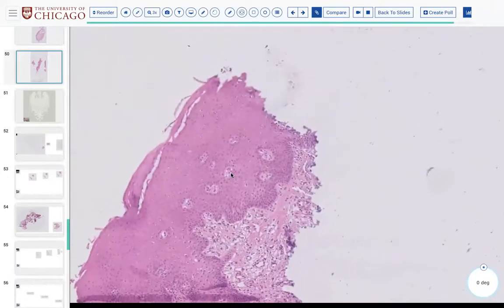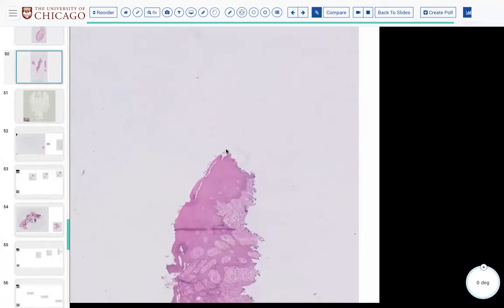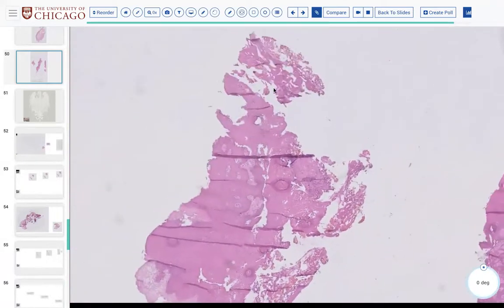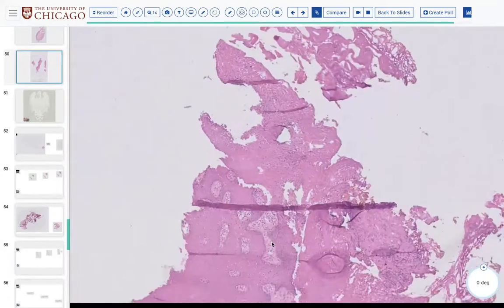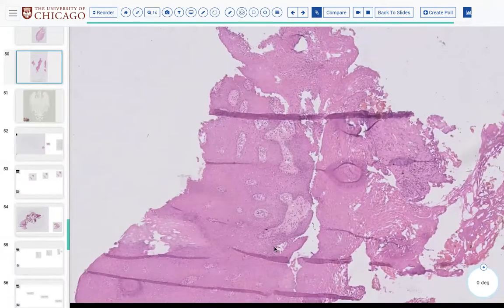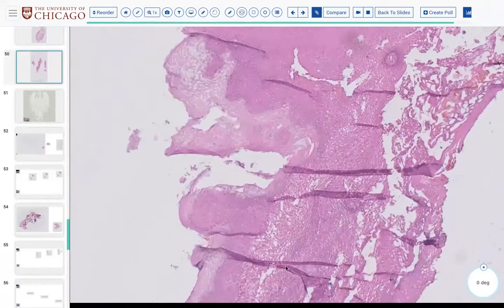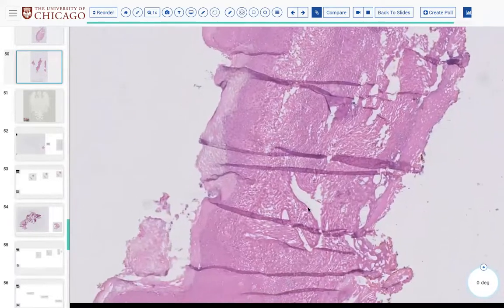All right, something or nothing? Something. Looks a little more dysplastic than the last case. Looks pretty disorganized. I mean, again, the orientation's not great, but at least in that other section especially, the last one looked pretty jumbled and like potato-y.